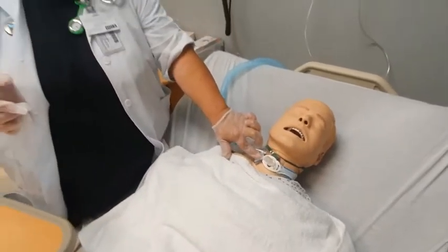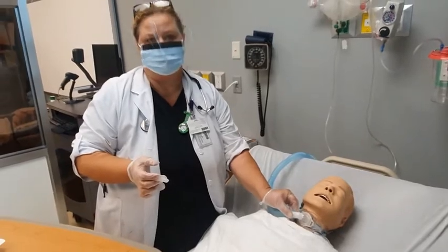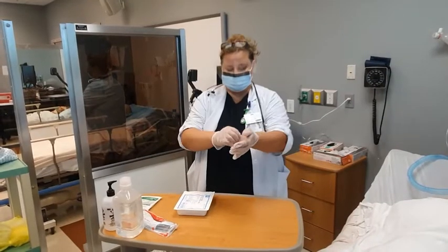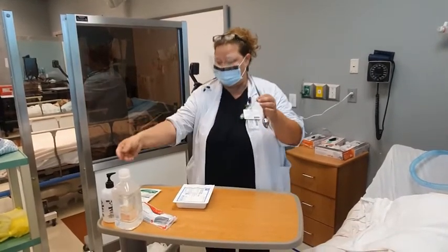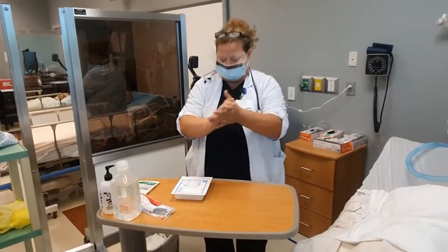And reapply their oxygen source. Make sure that you reapply the oxygen source. That is very, very important in the trach. Okay, we're going to remove our gloves and wash our hands, and open the Sterile Trach Care kit, setting aside our sterile gloves.